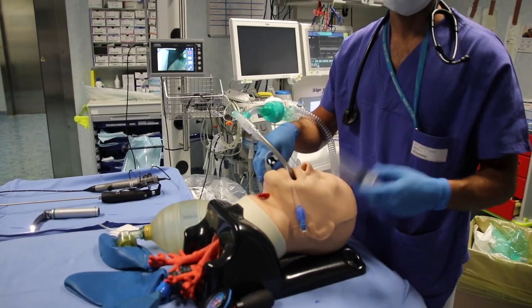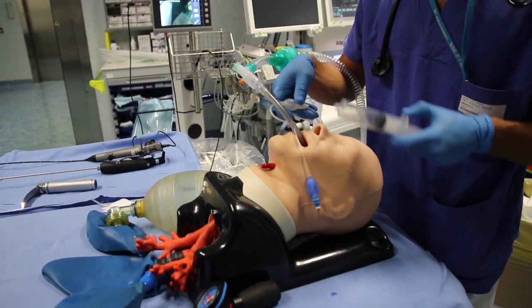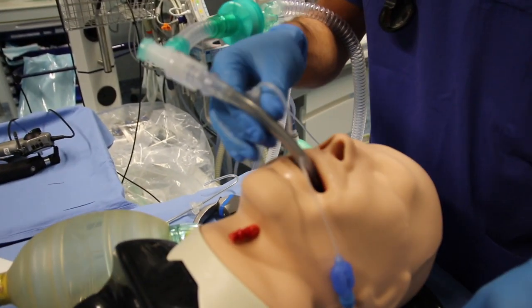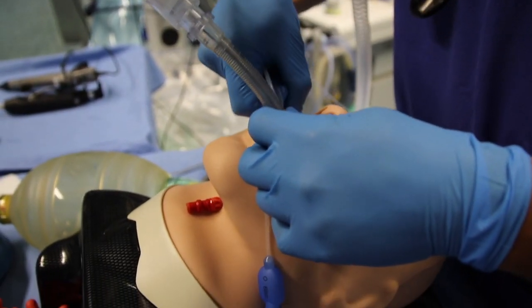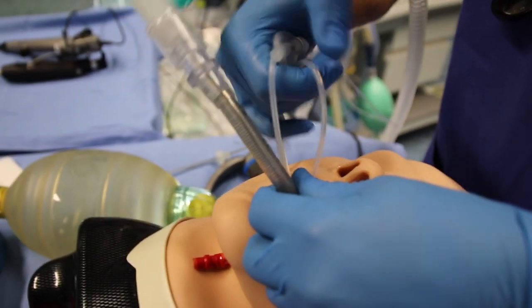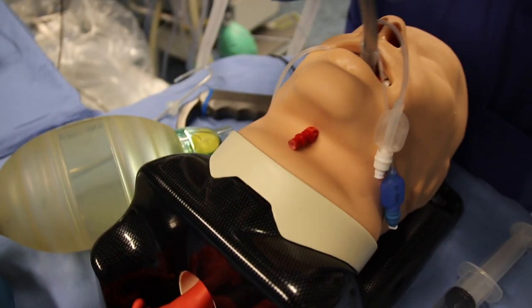In cases where patients need to undergo laparoscopic surgery or have their stomach drained, the distal cuff still placed in the esophagus can be easily deflated and removed by simply pulling it out of the patient's mouth. You can choose to leave it hanging outside or cut it off.